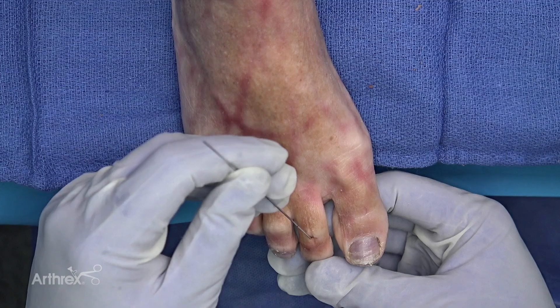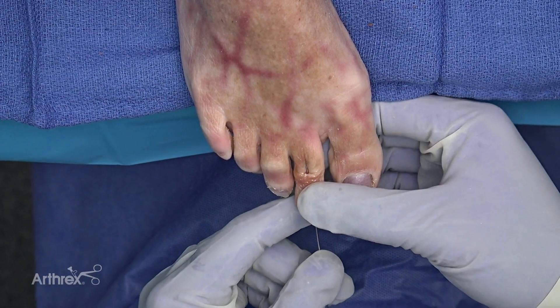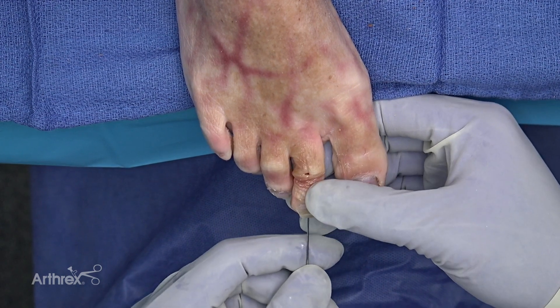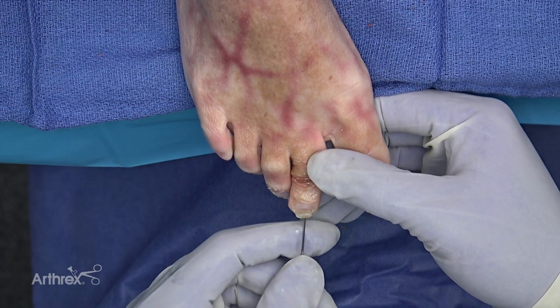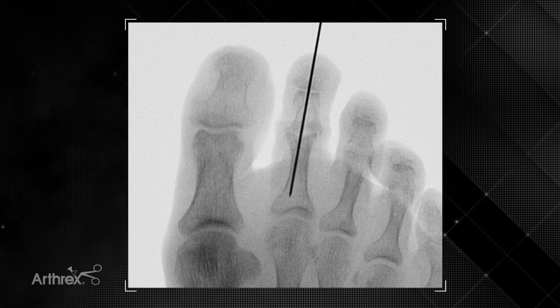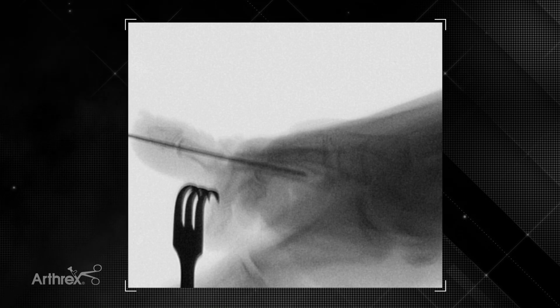By hand we're going to replace the K-wire antegrade through the middle and distal parts of the toe and then retrograde through the proximal phalanx. I think it's really important to check this fluoroscopically. Here this is going to be the final position of our toe, which is satisfactory in the AP plane and in the lateral plane — you can see it in the middle and proximal phalanges on the lateral plane as well.